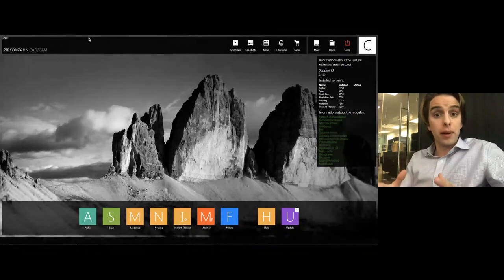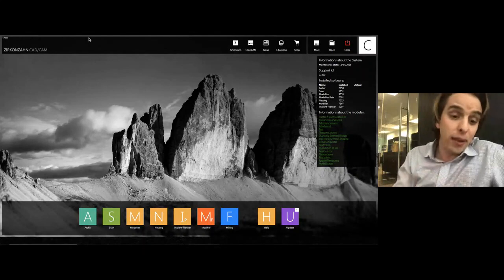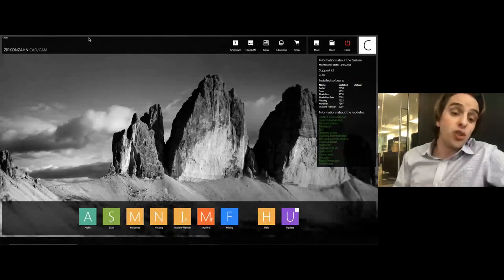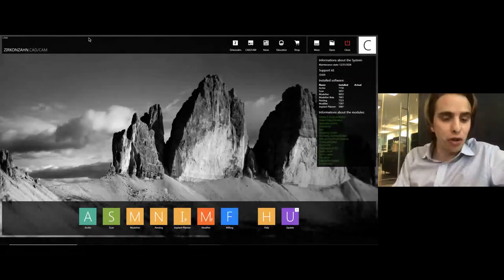Well, we typically receive a prescription on some sort of RX form, and we will place this in a lab pan with the impressions. And that is actually what takes place in the first software you see on the left-hand side, the archive software. This is essentially a digital database of all active or past prescriptions.